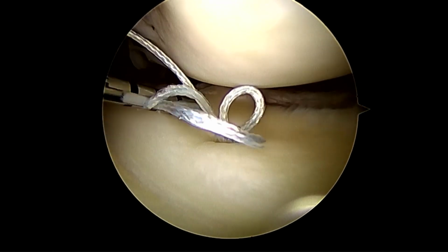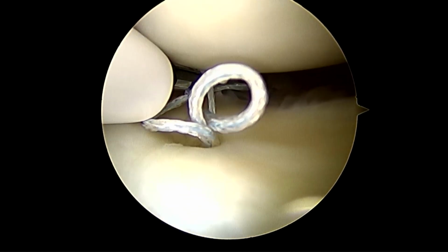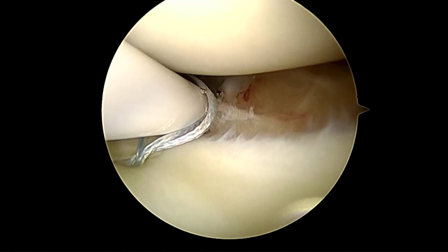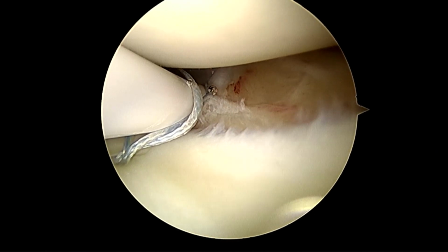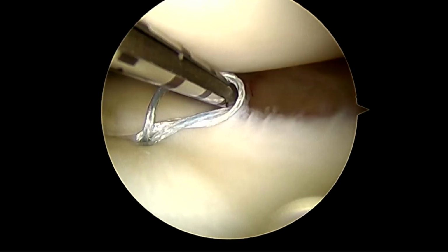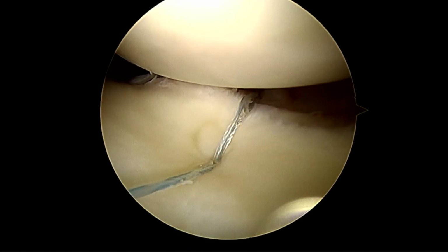And vertical mattress suture has better pull-out strength. We avoid taking a horizontal mattress suture, but sometimes there is a cost constraint, so we take a horizontal mattress also. And now it is going to the periphery and the peripheral part of the meniscus, so that we get good compression at the tear site with the vertical mattress type of configuration.